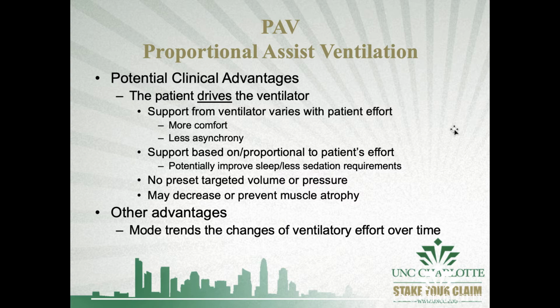But the advantage is that the patient drives the ventilator. Like I said, we're not necessarily targeting a pressure, we're not necessarily targeting a flow, we're not necessarily targeting volume. The patient determines these things. So when the patient determines these things and we set an appropriate percentage of workload, the patient will theoretically be more comfortable and have less asynchrony. So basically they're breathing like they normally would, despite the fact that they're getting positive pressure into the lungs. But the ventilator is working as a different neurological input and adjusting appropriately, so there's not that lapse between machine and human.